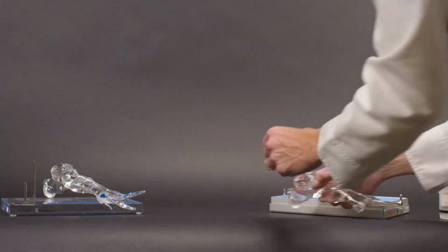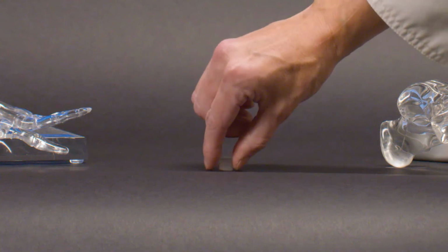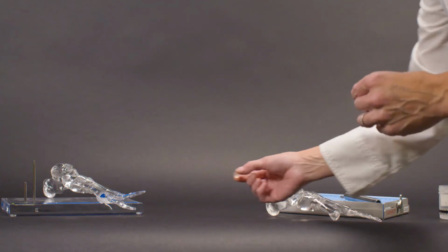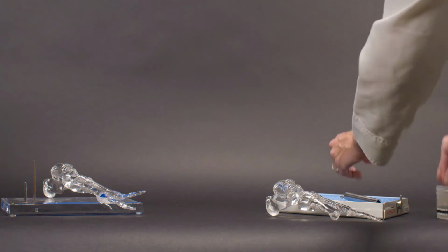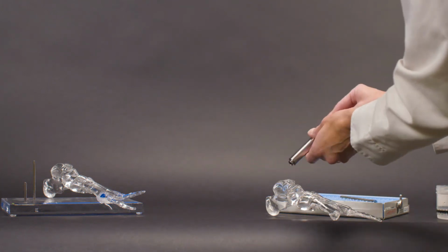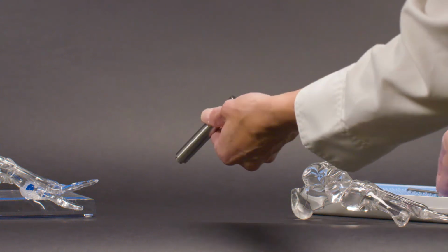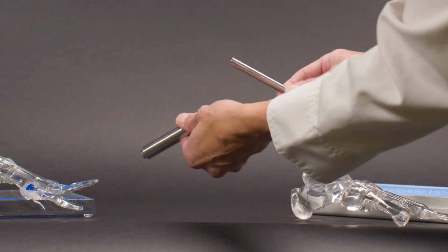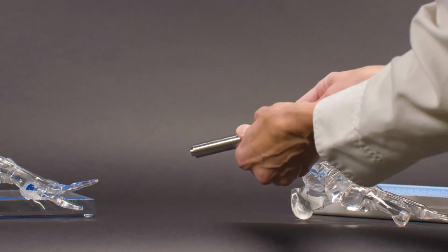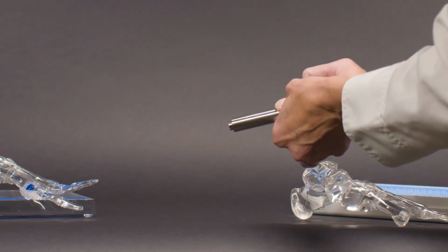And Cartiva is really just sort of a plastic, if you will. It's really nothing more than that. Almost the same material that we use in contact lenses. What we do then, and all this is sterile obviously, not like this situation, is insert it into this specially designed low tolerance device with an inserting stick, okay? And you very carefully impact it down to the end.